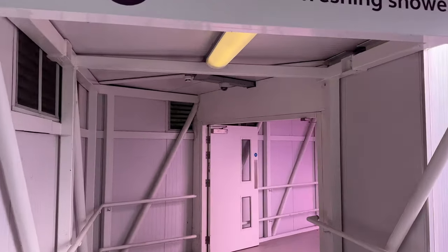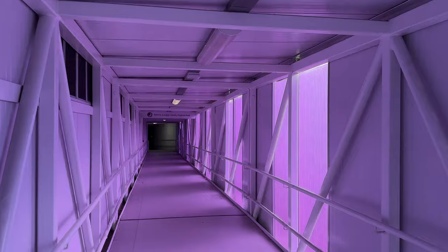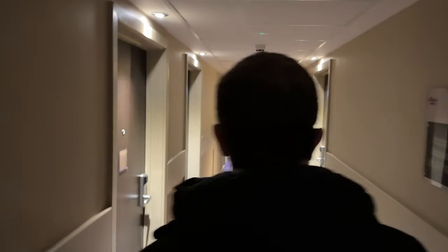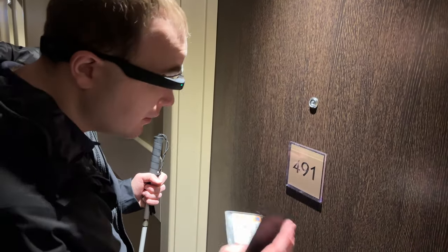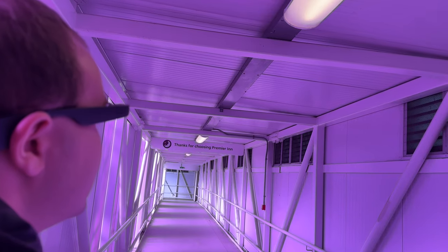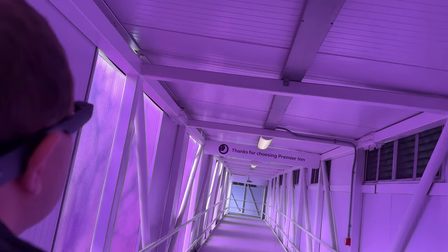So one area the Envision glasses might prove a little more helpful is in an environment like a hotel. To find out, let's see if I can find my room — Room 491. [Demo successful] And as we walk along this corridor which links the hotel back to the airport, you'll notice that instant text does generally do quite well with other smaller signage too. Thanks for choosing Premier Inn.